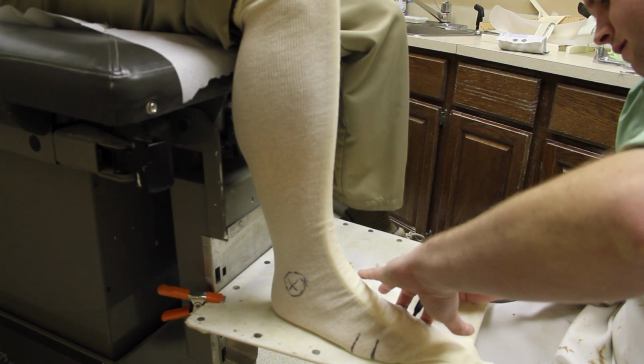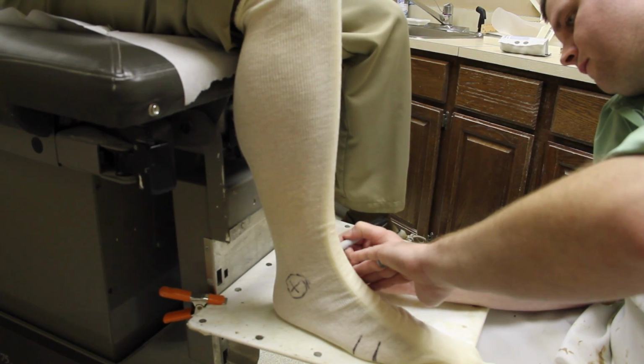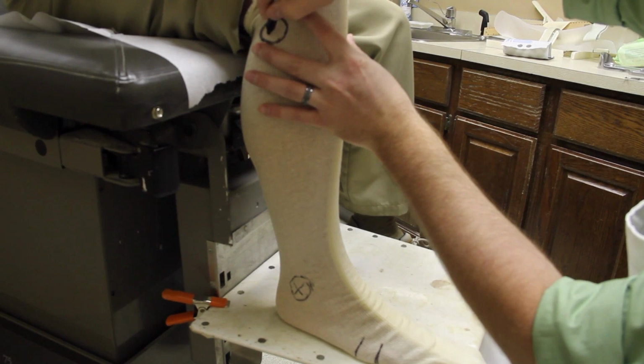Now he's marking sulcus on my foot and the metatarsal heads. Depending on whether I have toe motion or not will determine whether the brace is full foot or just trimmed to sulcus. Going to mark right below the fibula head.